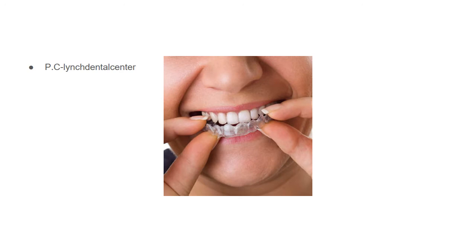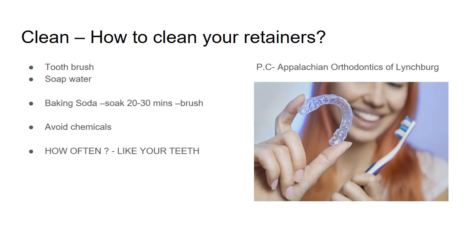For a clear retainer, the instructions remain the same. Position the back area of the clear retainer first, then the front area. Again, don't use one hand, don't start with the front teeth first — do it bilaterally with both hands, positioning the back region first.